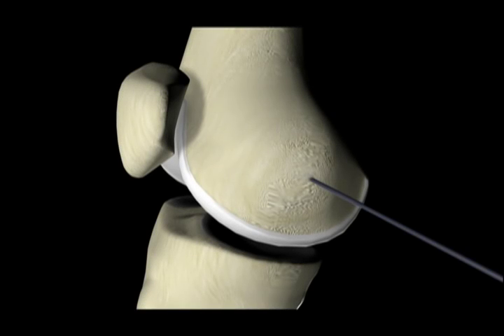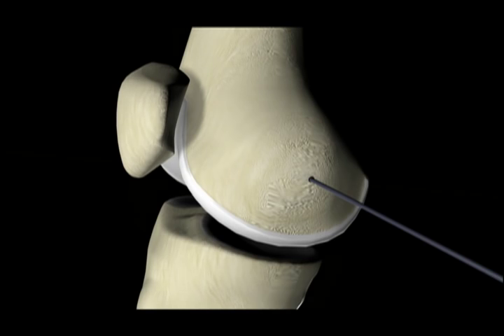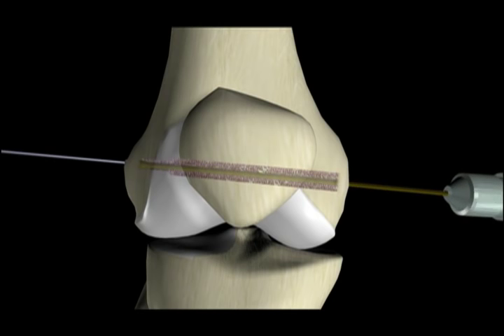A pin is drilled to the lateral surface of the femur, being careful not to deviate too anteriorly into the articular surface of the trochlea. The pin in the femur is overdrilled with an acorn reamer bit to a distance of 30 to 35 millimeters. The remaining tunnel length is overdrilled with the 4.5 millimeter drill bit to accommodate the passage of the toggle lock device.